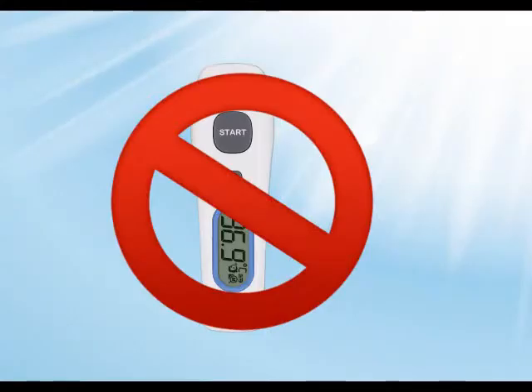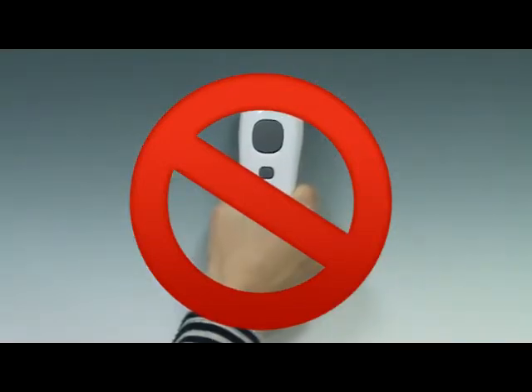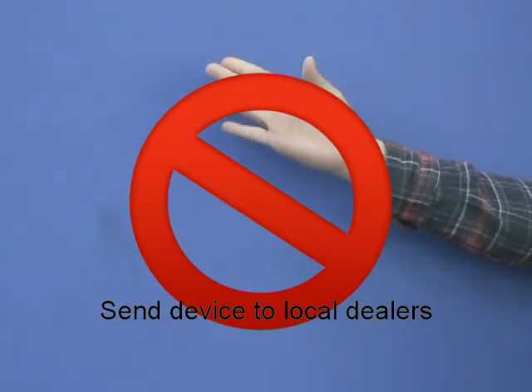Keep the unit dry and away from direct sunlight. Do not submerge the thermometer in any liquids. Holding the thermometer too long may cause a higher ambient temperature reading of the probe, which could make the measurement lower than usual. If the thermometer is dropped, please check for damage. If you are unsure, send the device to your local dealer for service.